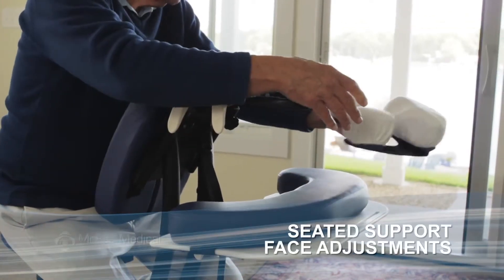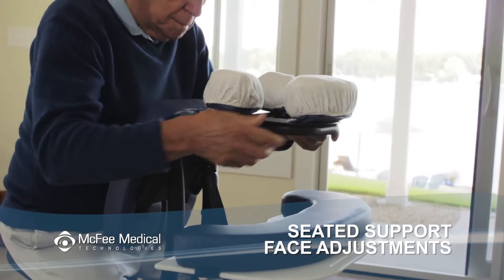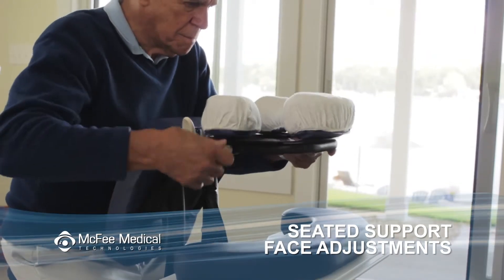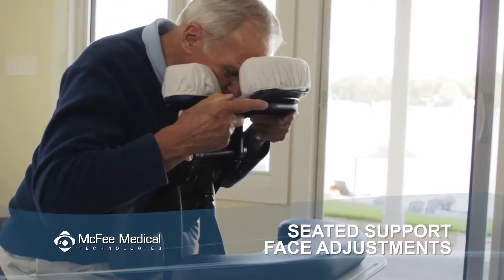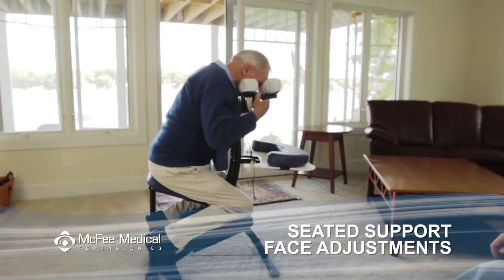Secure either the crescent facepad or the three-piece facepad to the quick lock by matching up the velcro strips. Loosen the knobs and release the cam locks to adjust the face rest. Hold the face rest with one hand so you can lock the cam locks with the other hand. Put your face into the pad and relax forward into it until you find a comfortable position where you're looking and facing straight down.